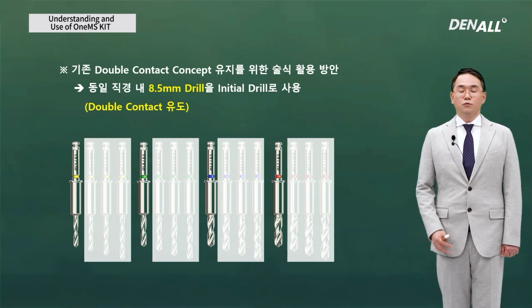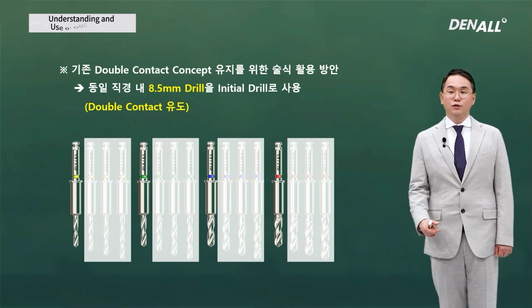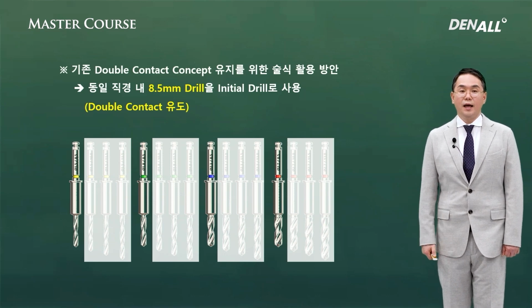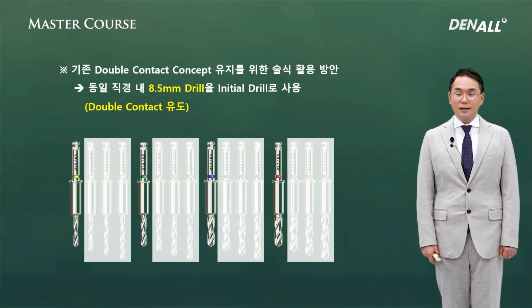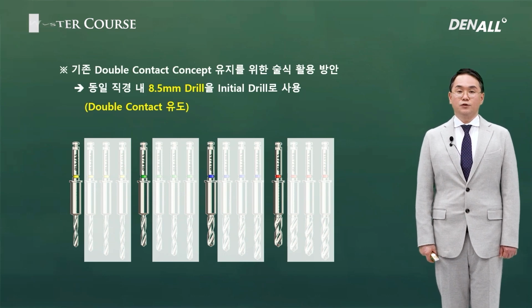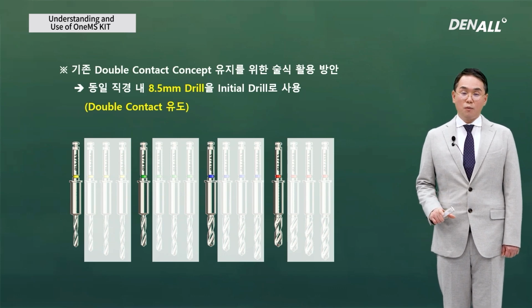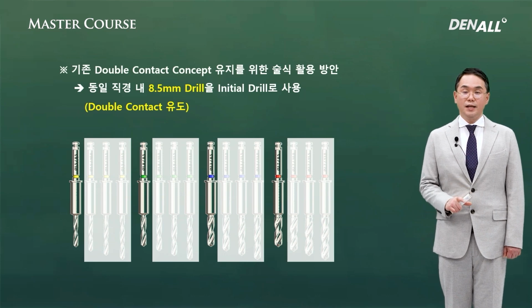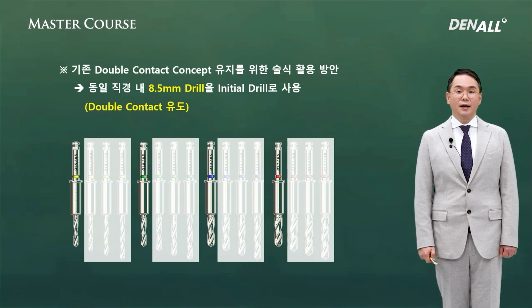There's no initial drill in the OneMS kit. In the OneGuide kit, initial drills are available. Using the initial drill, the first marking on the bone is made to have apical bone contact. When you use the OneMS kit, there's no initial drill, so the 8.5 length drill should be used first, like an initial drill, rather than placing short implants in the anterior mandible. 10.0 or 11.5 or 13.0 millimeter long implants are placed. If you use the long drill as an initial drill, the guide contact will not be achieved.